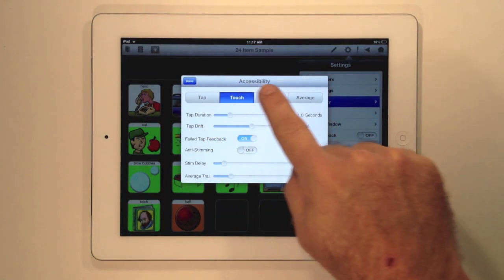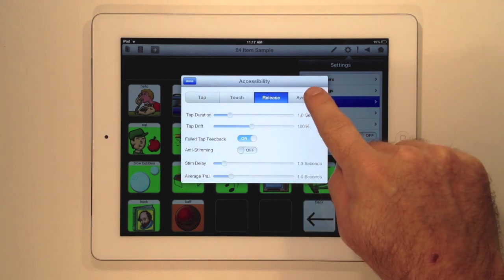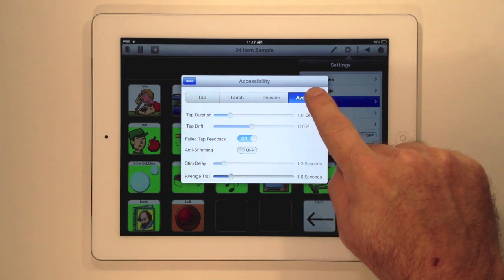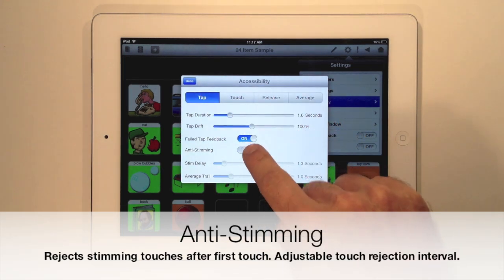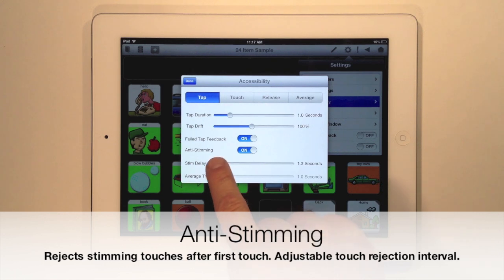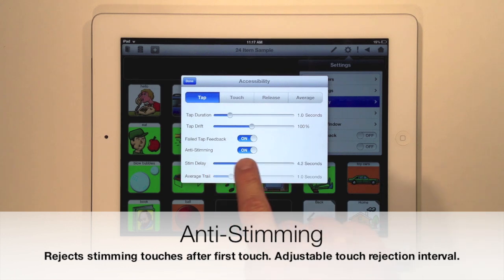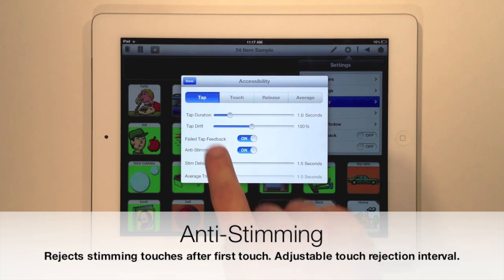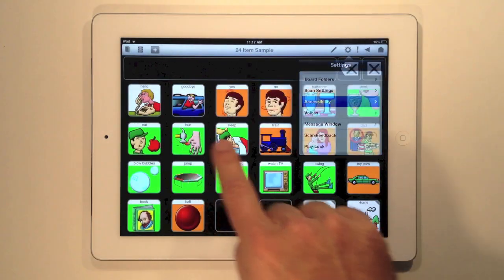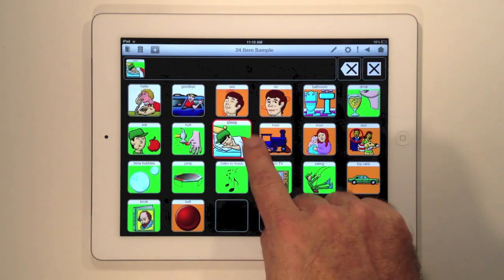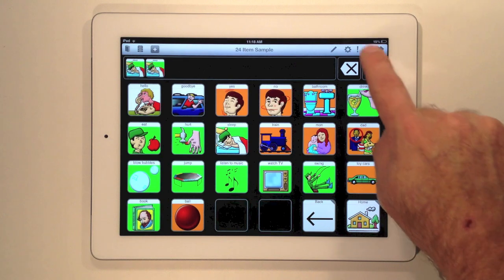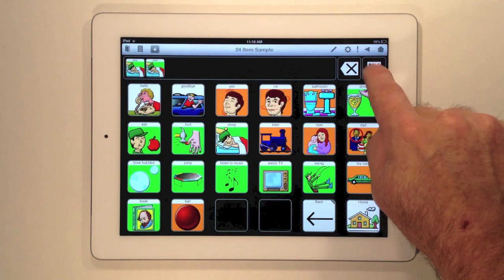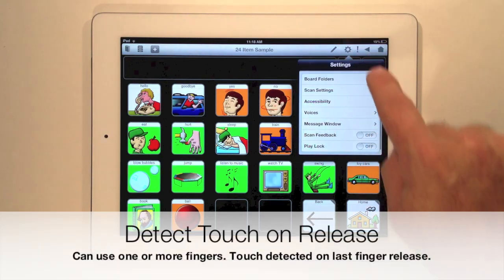Anti-stemming works by rejecting taps during a specified time period. You can adjust this time period between a half and eight seconds. After the initial tap, any tap made during this time span is rejected as a stimming tap. You can adjust this value to what you need to best accommodate your child or student.